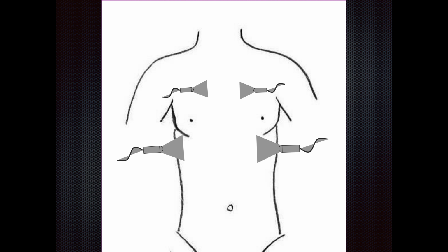Here are your flanks. This is where you're going to be capturing the diaphragm on each side of the chest. This will let you know if there's fluid above the diaphragm or below. That diaphragm serves as a highly acoustic specular blockade, so it allows ultrasound beams to come all the way to it, strike against it, and go all the way back to the probe. So if there's any water interface on each side of this highly echoic structure, you're going to see that quite visibly, and you'll see in these images how quickly the water or the blood, depending on the situation, jumps out at you.